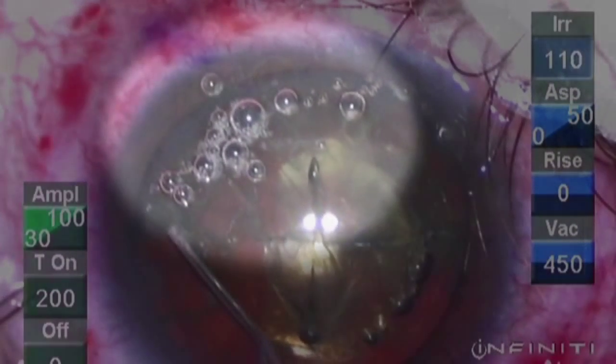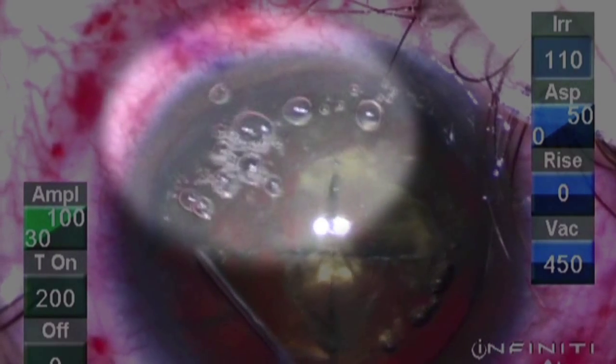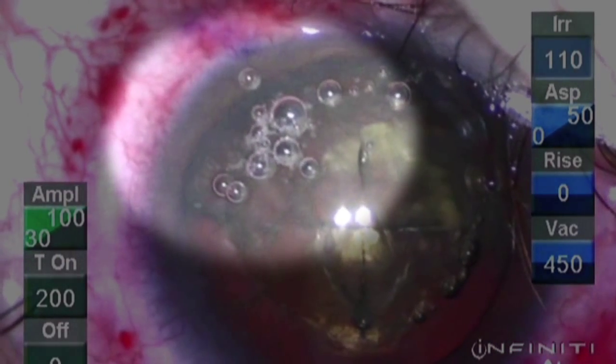This can be frustrating for the surgeon, expecting femtolaser cataract surgery to make your cases go easier and not more difficult.